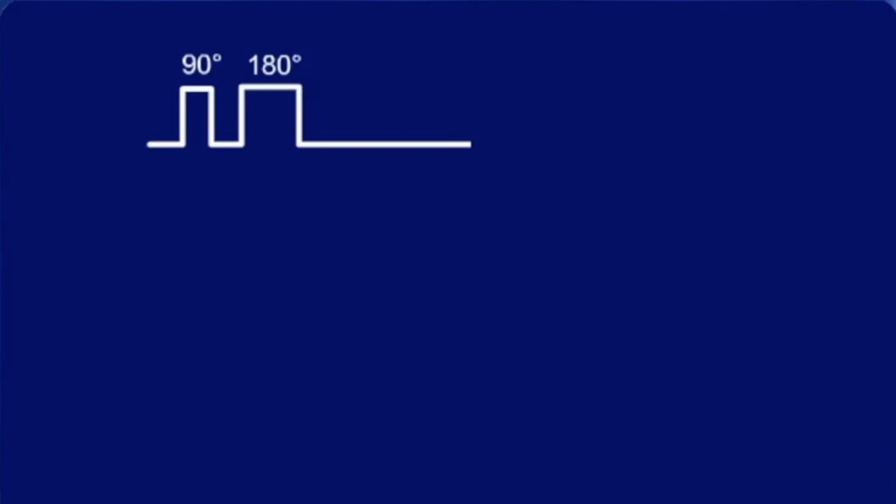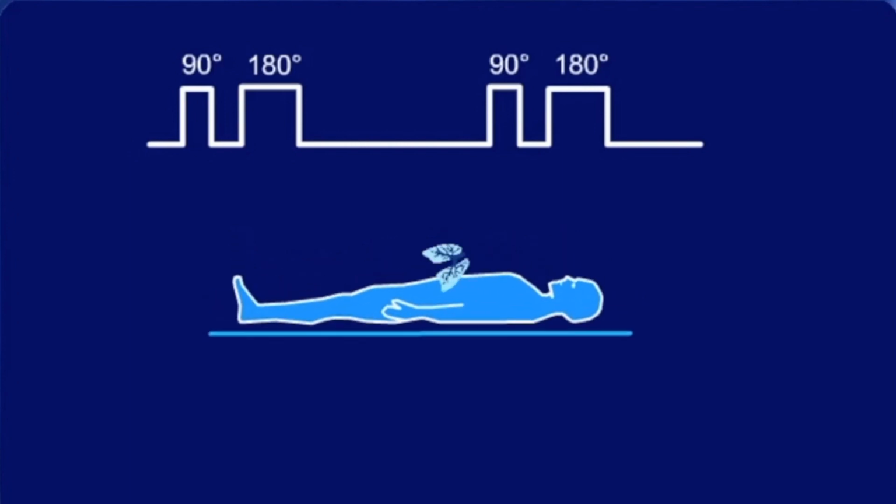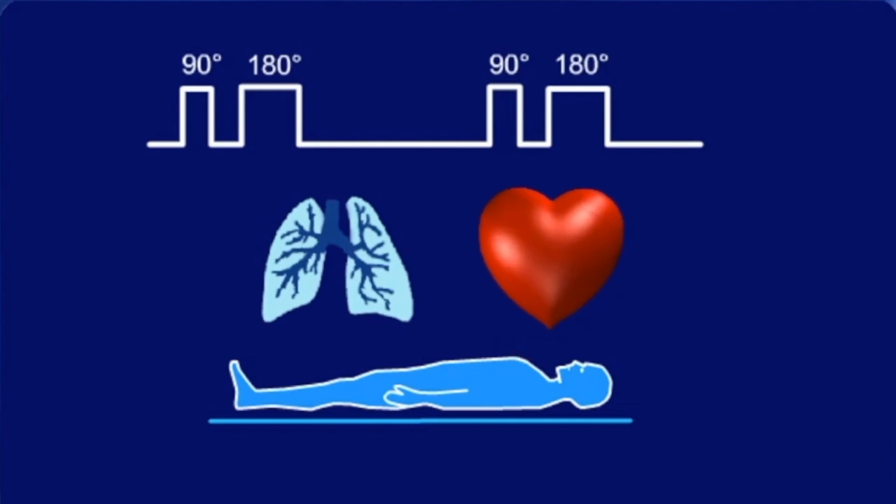As the normal imaging sequences take quite some time, only a limited number of patients can be examined. It is also often very difficult for the patient to lie still for a long time, and image quality decreases with movement. In addition, there is always some unavoidable motion, like respiration and heartbeat.